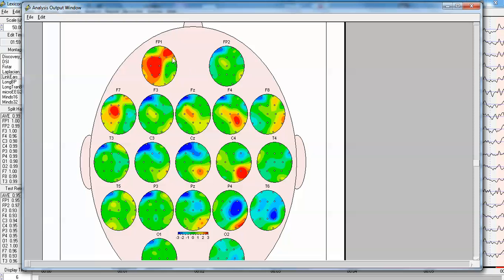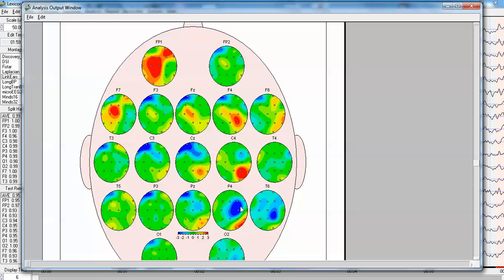Here's F4, and there's F4 up here. F4 is the receiver of the information coming from FP1. In the case of P4, there's no information flowing to P4 from these regions, the surrounding regions, because it has disconnection.